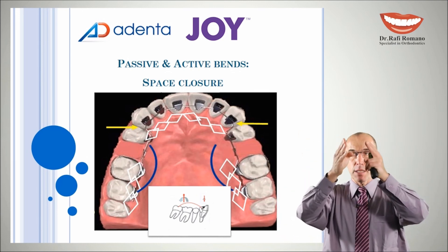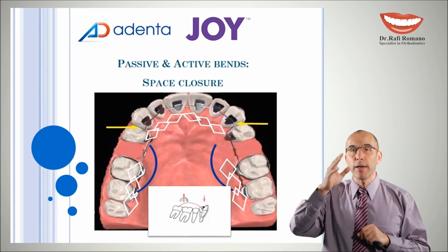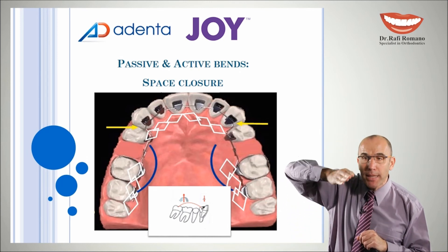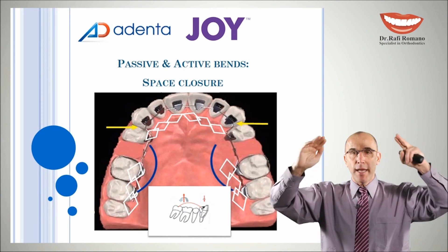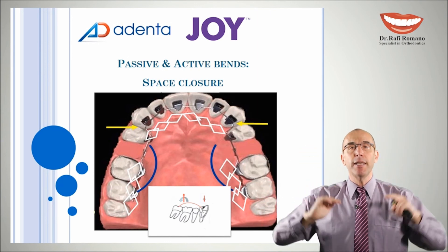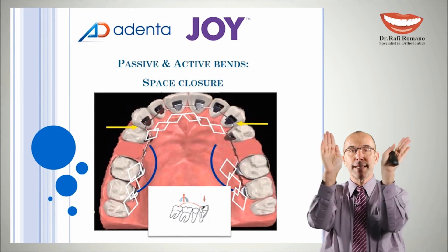So we create this mushroom shape and then we take the wire and create some compensation bands horizontally and vertically in order to avoid the teeth from tilting.